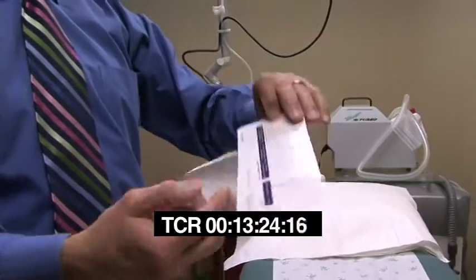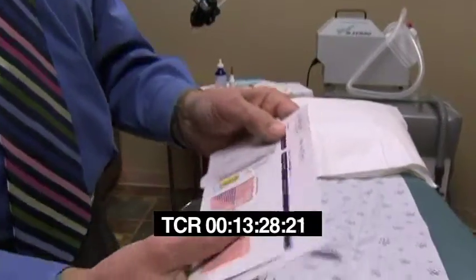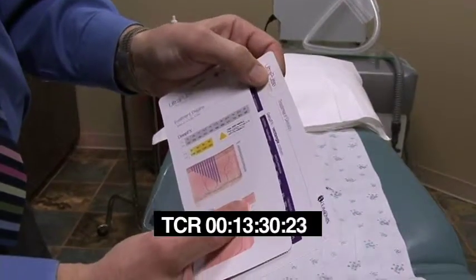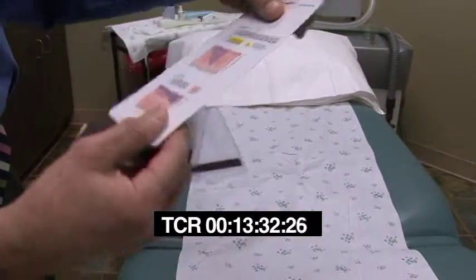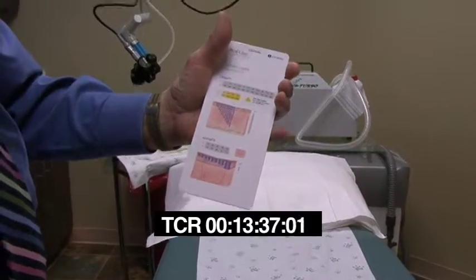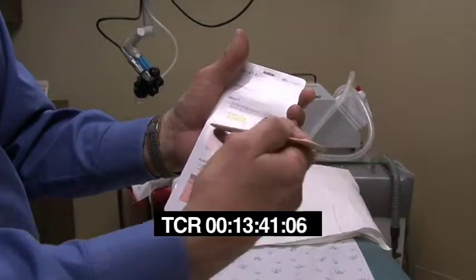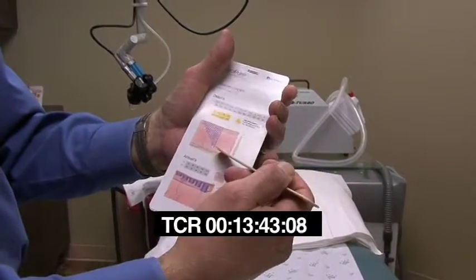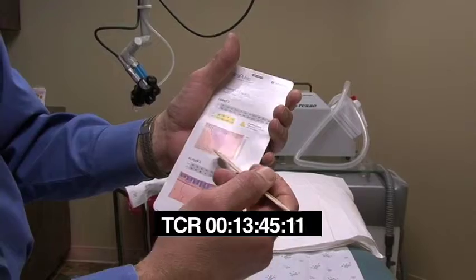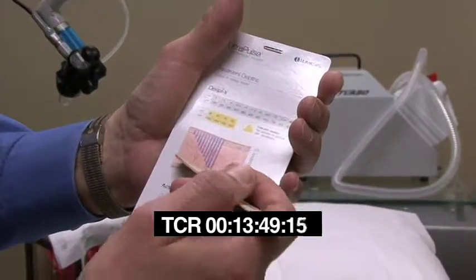This gives you an idea of what you were actually seeing. Gotcha. At a close-up, and then this, as I was telling you before, allows us to penetrate to whatever depths we want. This top layer here is the epidermis of your skin. This is the dermis, and then this is the fatty layer. Your hair follicles and blood vessels all generate down here, sweat glands and so on.